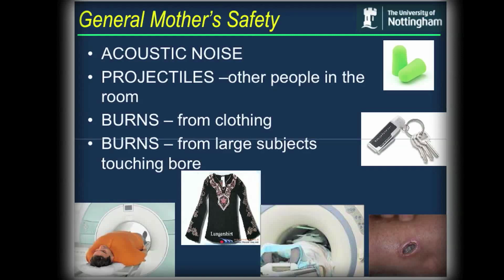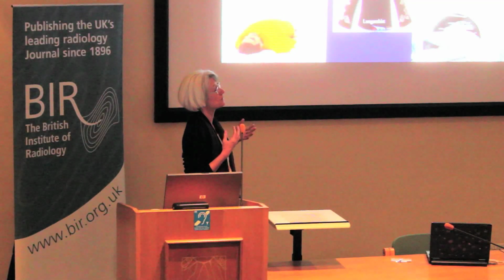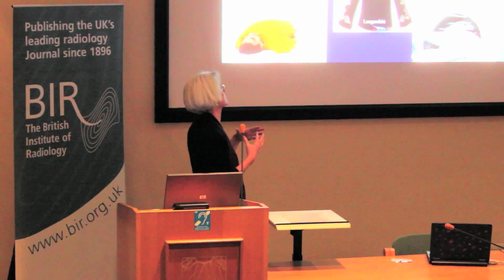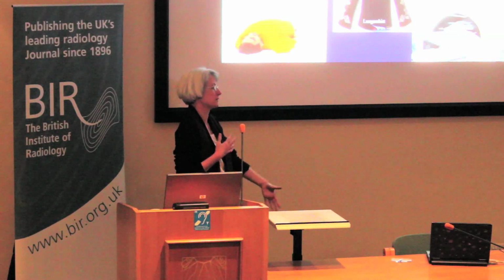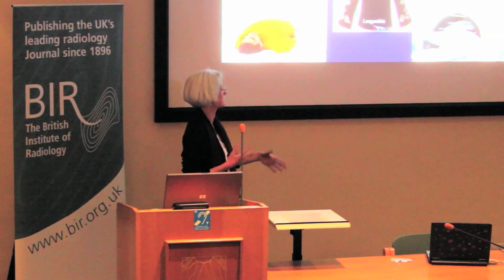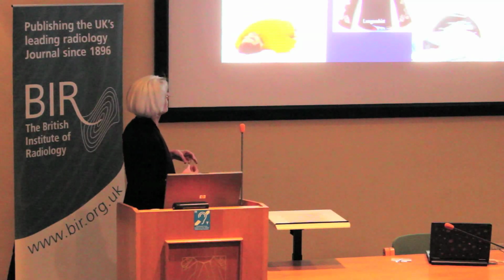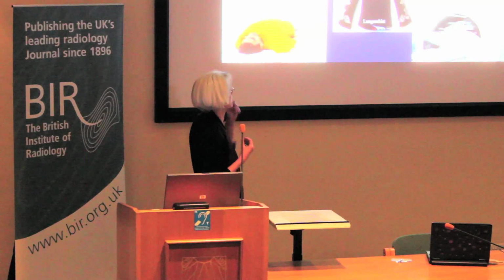And of course, potentially relevant with scanning pregnant women, obese people, or anybody to be honest, touching the sides of the magnets can get burns. Now we don't have a lot of problems, again, in our research environment, even in scanning diabetic mothers, with them being too large to go in the magnet, obese mothers. It seems that being obese plus being full-term pregnant doesn't seem to be a limiting factor. I'm sure the clinicians here can say more about that. But once you're large and you're touching the side of the magnet, there is the risk of burns.